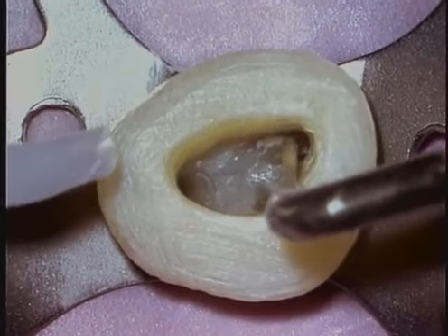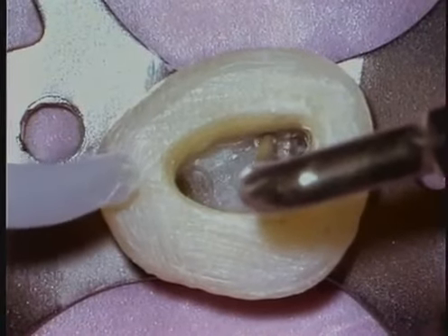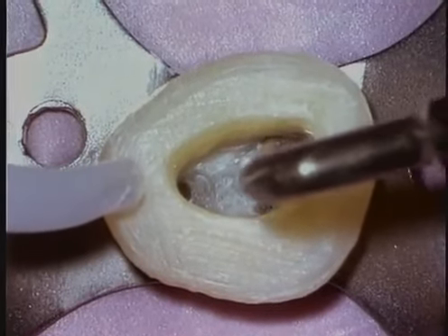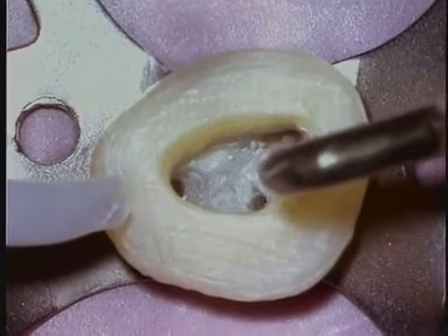This would be a good time to show the power of transillumination. Once the access has been roughed in, ultrasonics is employed to begin chasing along the groove that emanates off the MB1. Recall the breadth of the MB root in its buccal lingual dimensions and notoriously having the furcal side concavity. If we turn the overhead light off and turn our microscope lights down, assistants can hold the fiber optic wand either below or above the rubber dam and play the light into the tooth perpendicular to the long axis. We can work in these conditions very safely and get a nice perspective, a different perspective if you will, from typical lighting.